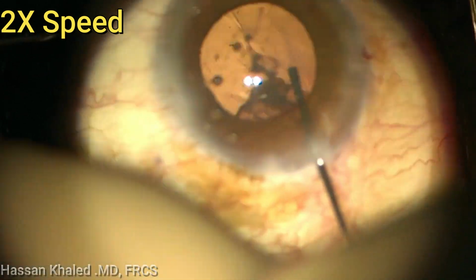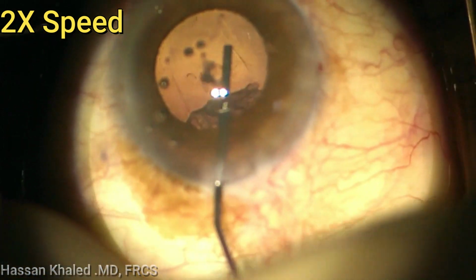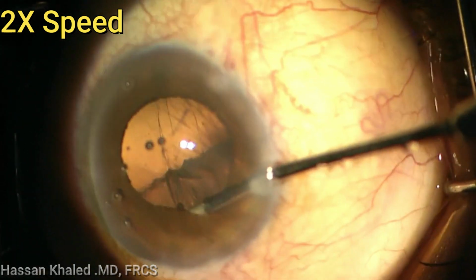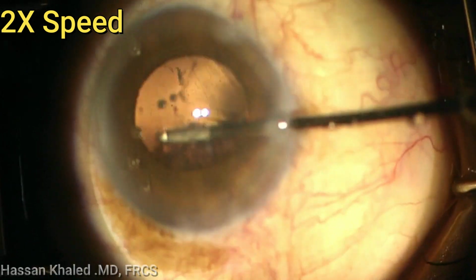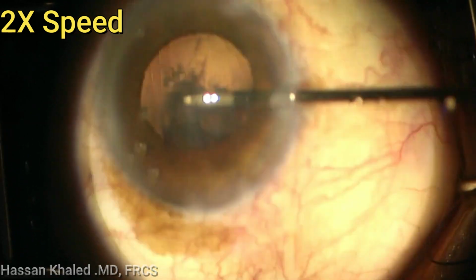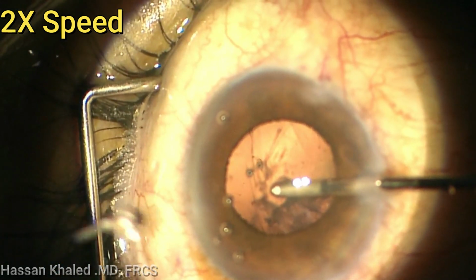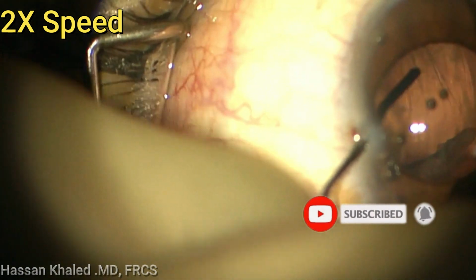You can see I have a good remnant of posterior capsule. Also the anterior capsular remnant is intact. Now continue dry removal of the cortex. As I said, this step needs you to be patient and it takes time to remove the cortex.